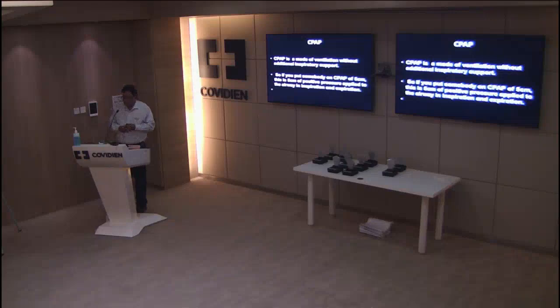The only other thing I want to talk to you about very briefly is that sometimes you switch from a ventilator to NIV. Generally, you can use the conventional ventilators or you can use the BiPAP devices. So sometimes you can change from a small ventilator to the bigger ventilator or vice versa. So you should know what is pressure support. Generally, when you're on a ventilator, use pressure support for NIV. So if somebody's on a PEEP of 5 and a pressure support of 10 on NIV, on the smaller machines it is called IPAP and EPAP.